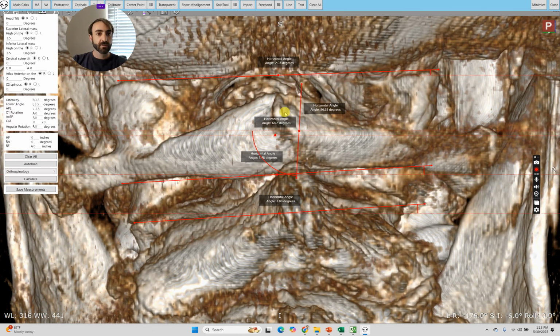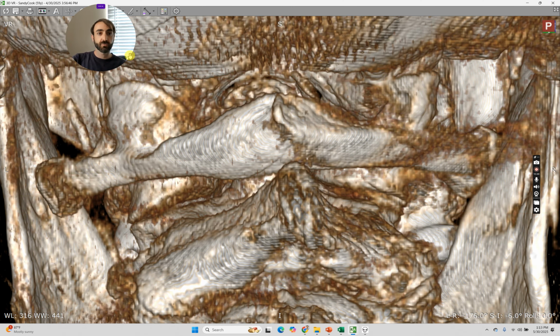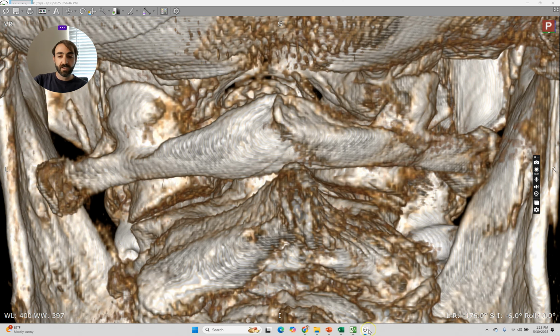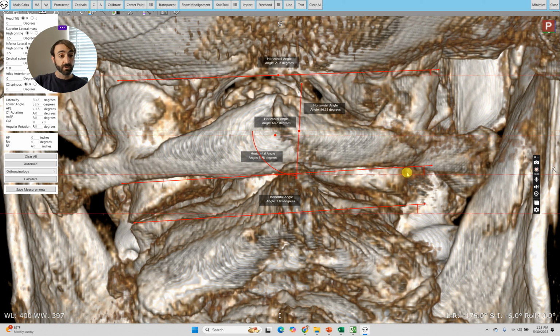And so I try to create this in a way that was similar to VizTech. You know, I used VizTech for a long time, and I didn't want to just import things into VizTech, because then it was screenshot, import. It would take too long. What's nice about the way the toolkit is built is if something's kind of blurry on the right side but clear on the left side, I can minimize toolkit, I can just slightly modify that density, and I can open toolkit back up and see if it's still good.